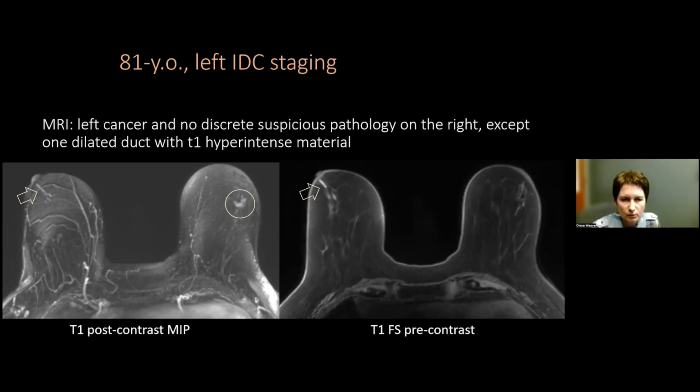So the point of me bringing up the MRI here is that neither CEM nor MRI showed any focal pathology in the area of concern, in the area of those mammographic microcalcifications. However, as Dr. Phillips pointed out, CEM is a combined exam, and the suspicious finding on low energy images are enough to do a biopsy and to do further workup, even if there is no enhancement on recombined images.